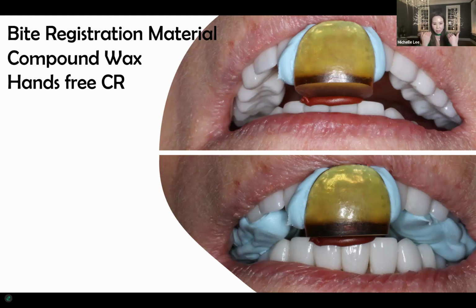I had a conversation with my lab. I was not doing it this way before. I was using the anterior deprogrammer, but I wasn't locking it in. If there was any type of micro movement, when they were going back and looking at the scan, he would get two different bites. And so this is really streamlined and has given me some confidence that I'm starting the position in appliance therapy in a seated condylar position. So I'm utilizing the anterior deprogrammer as a way to take my record now, which is awesome.